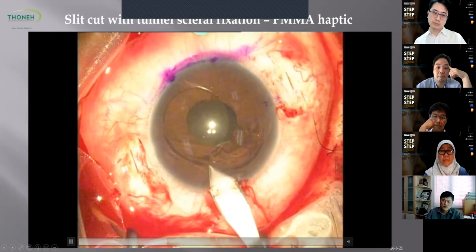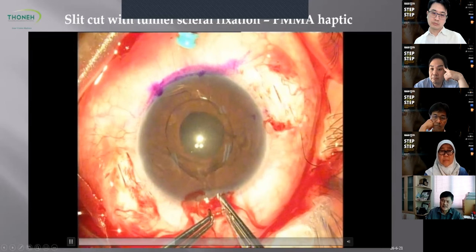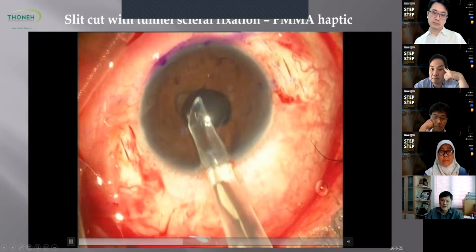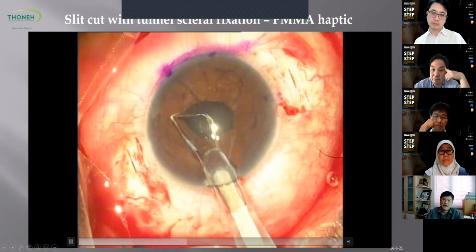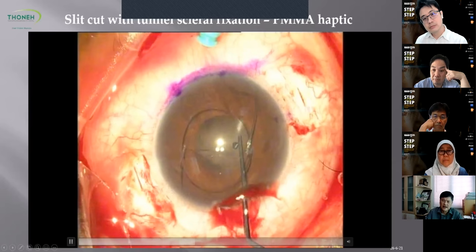And then using a reverse Sinskey hook, I hook up the haptic and support the haptic with corneal forceps. Then using a St. Martin, go in and at the optic haptic junction, firmly grab the optic and pull the lens out. This is followed by implanting a three-piece IOL that comes with PMMA haptics. Okay, I will implant the IOL into the anterior chamber. And then I will rotate the lens and put both the haptics into the anterior chamber as well and position the haptics in such a manner.